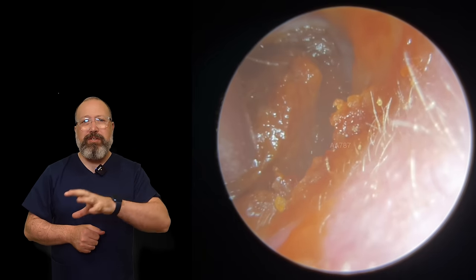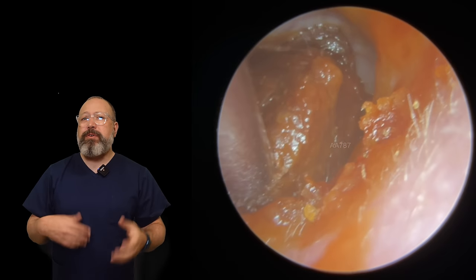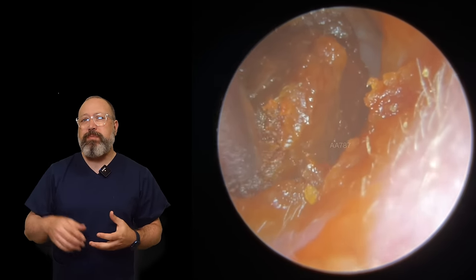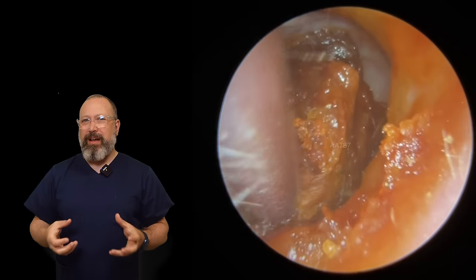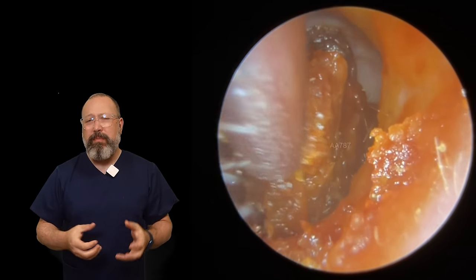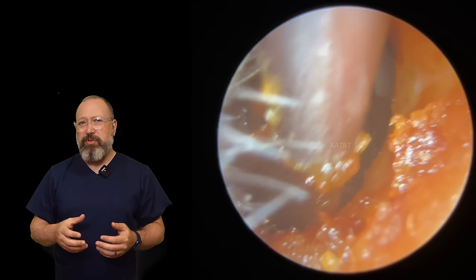Right at the entrance to this canal we've got a very soft, mushy type of wax around the outside edge. Usually this is because the patient has used some softening drops, but in this case there is a lot of wet, mushier wax that's gone all the way down to the eardrum, so not the easiest of removals to do.